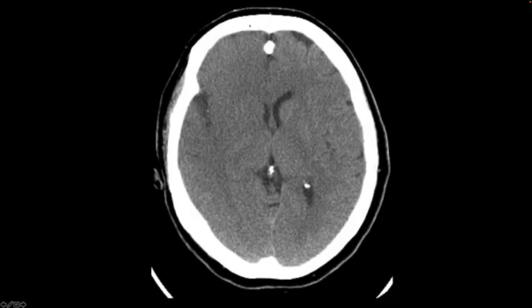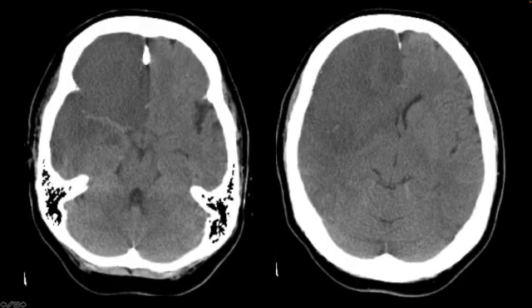You'll also notice sulcal effacement within this right cerebral hemisphere here. We can see nice open sulci on the other side — over here, not so much. That's a sign that we're getting some mass effect. We've even got some early compression of the lateral ventricle.